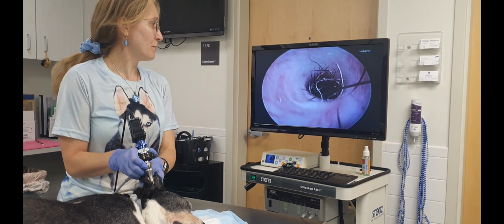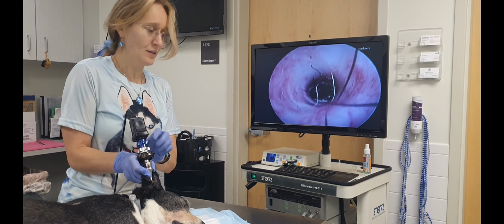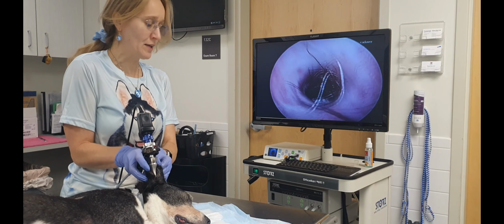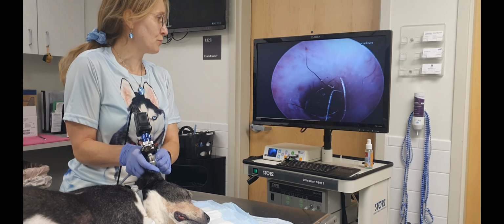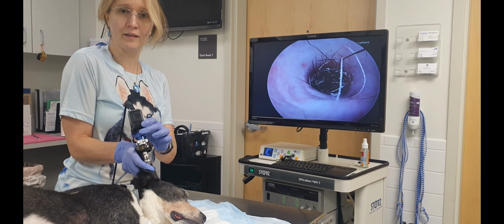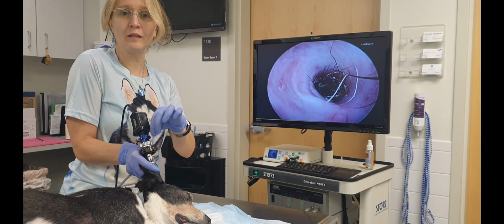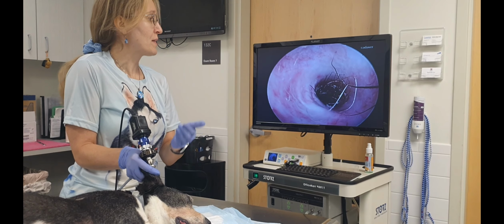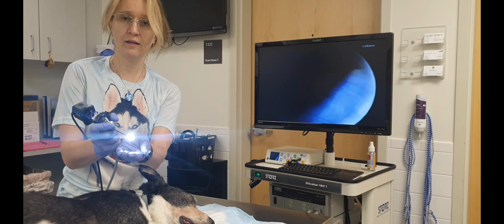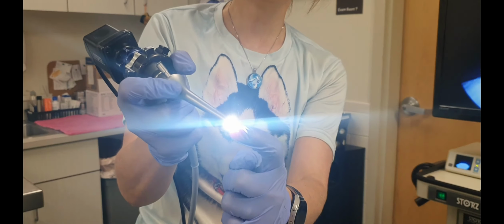In this way, what may be beneficial, first, is that you can hold the pinna with the same hand that you're holding the videootoscope. First you go inside and you need to hold it separately, but when you're already in place, for example, you decided to use some tool, you can see I can hold the ear pinna with the same hand I'm holding my videootoscope. And then I have my other hand free to manipulate the instruments. So that's one benefit.